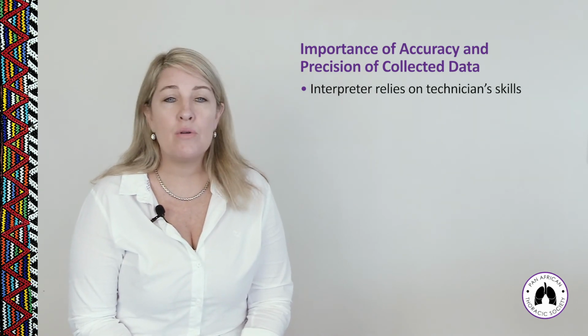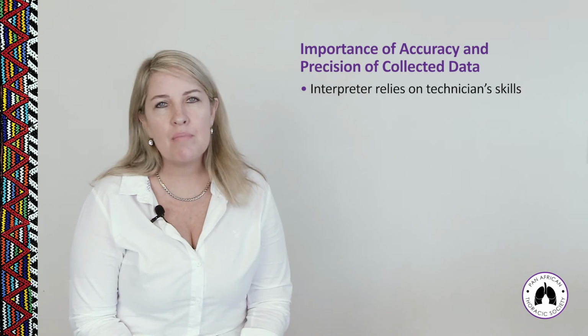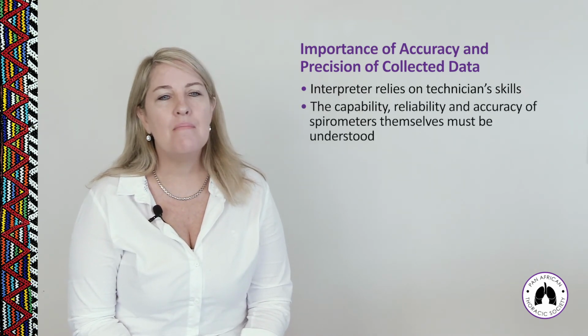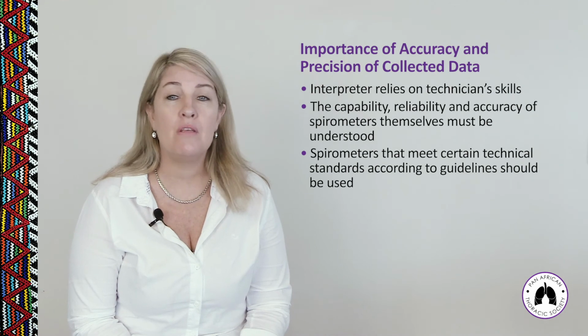So in spirometry, there is no substitute for a well-motivated and well-trained technician. And of course, the capability and reliability and accuracy of the spirometer itself must be understood. Spirometers that meet certain technical standards according to the guidelines should be used for testing.